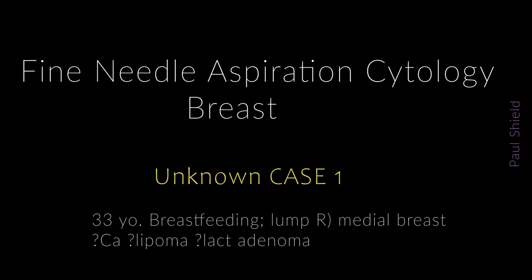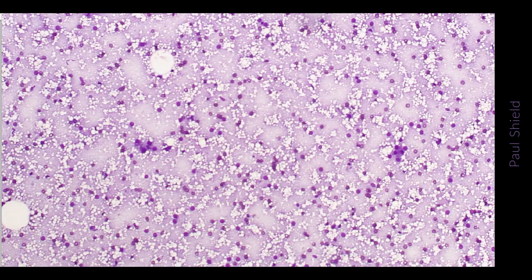So this was on a 33-year-old, a lump in the right medial breast, and clinically she was breastfeeding, and the question was carcinoma, lipoma, or lactating adenoma. See what you think.